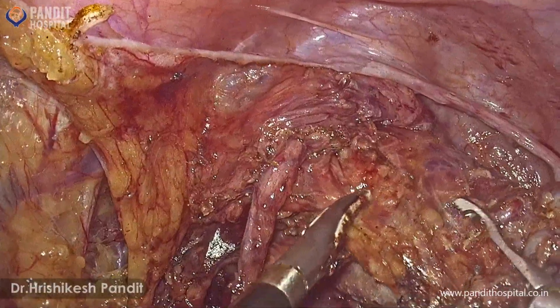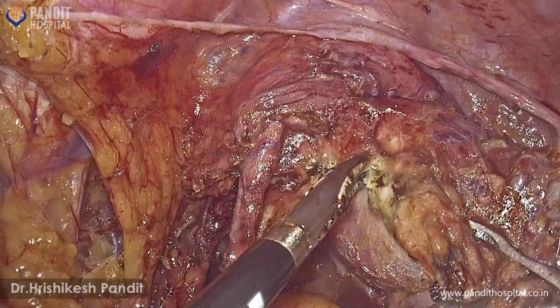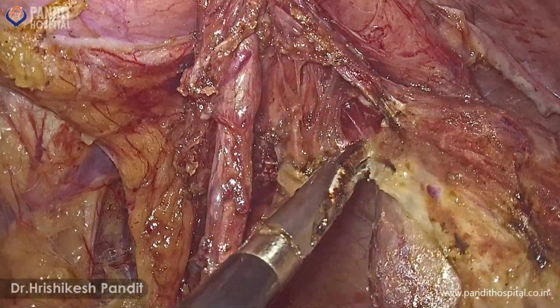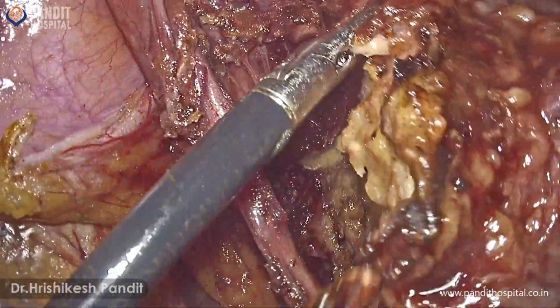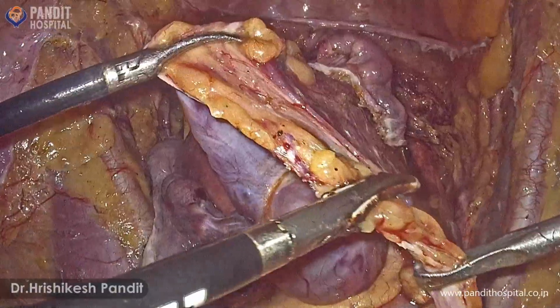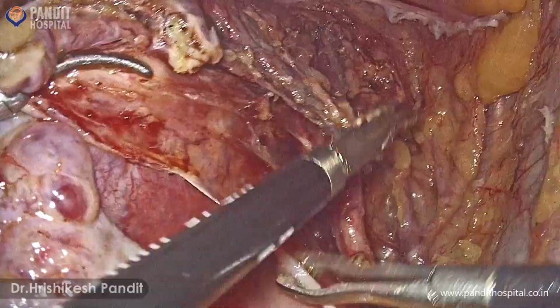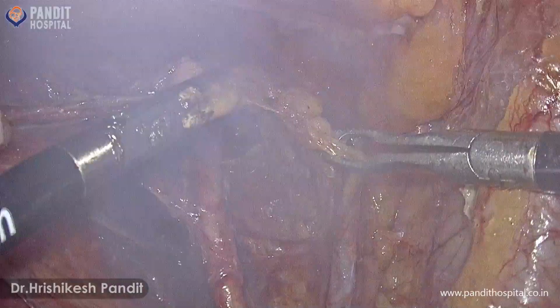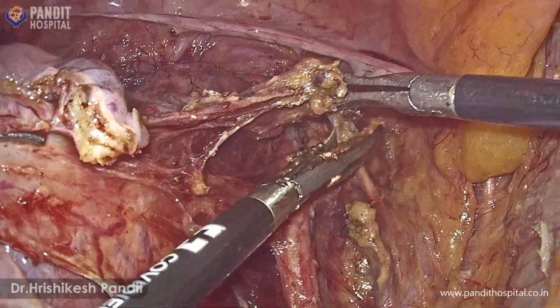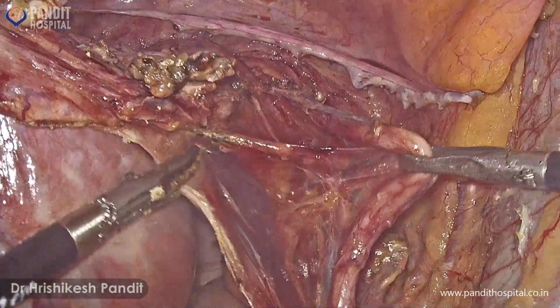When taking out the parametrium, one should not go very much lateral on the ureter side, as we may compromise the inferior hypogastric plexus. Similarly, on the right side, the IP ligament is coagulated and cut, and the right-sided uterine artery at origin is coagulated and cut, and reversed and flipped onto the ureter. This is known as the Barrett's maneuver, which is important for completeness of parametrectomy.